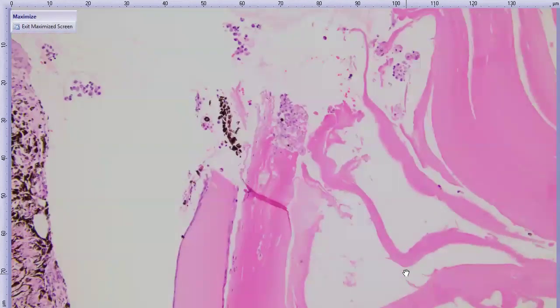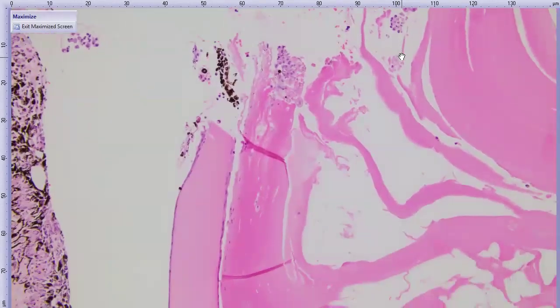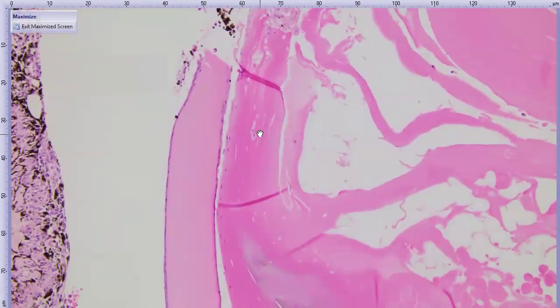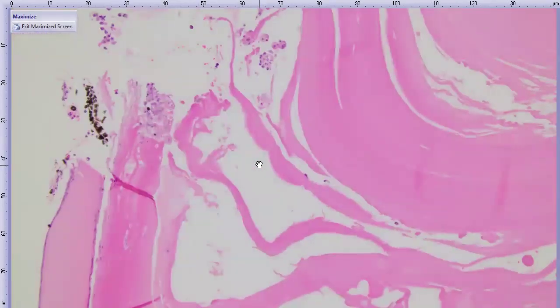As we take a closer look at the lens, we can see some cataractous degeneration as well as these macrophages in here, with this discontinuous portion of the lens being a little bit sharp. As stated earlier, a lot of times we will see a nice curling effect of the lens capsule when it ruptures, but sometimes we don't always capture it, and the lens was a little bit fragmented as well.